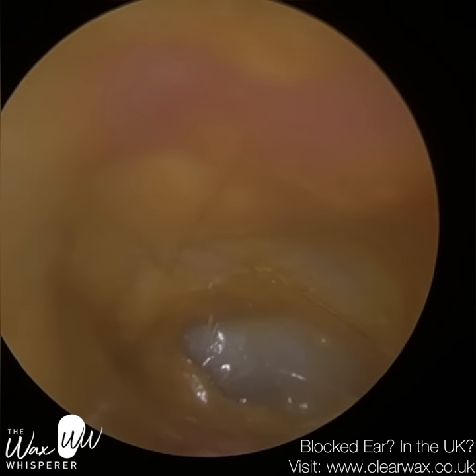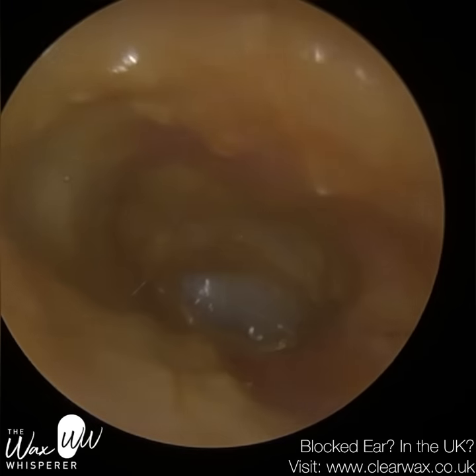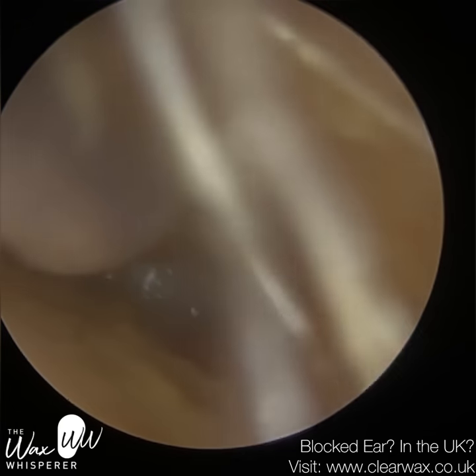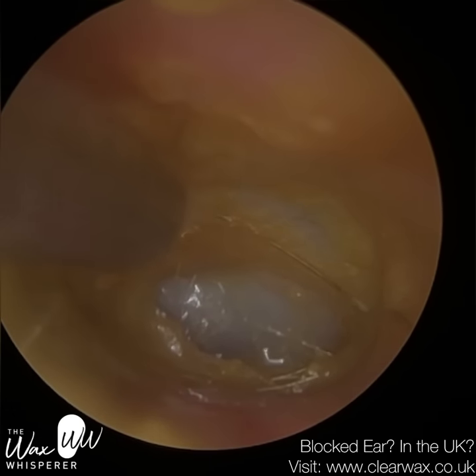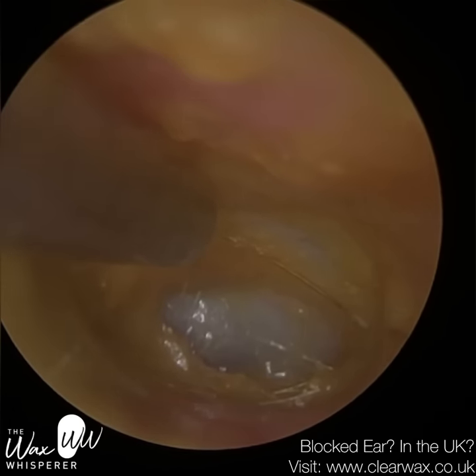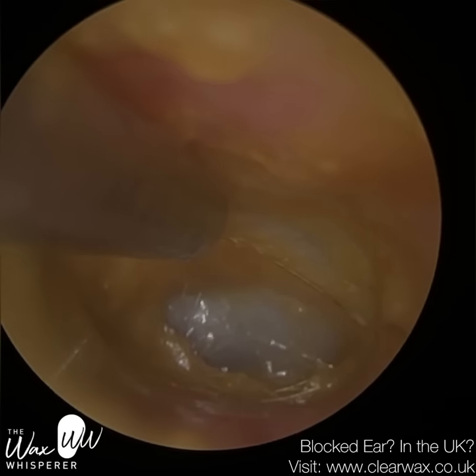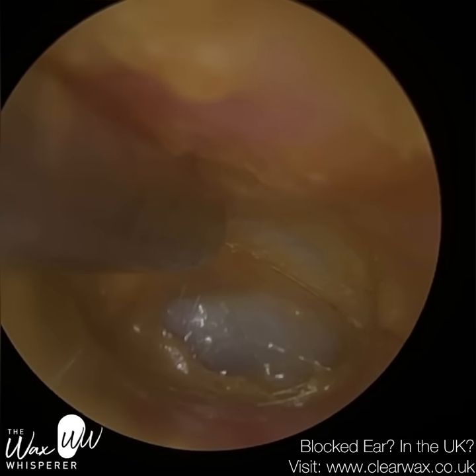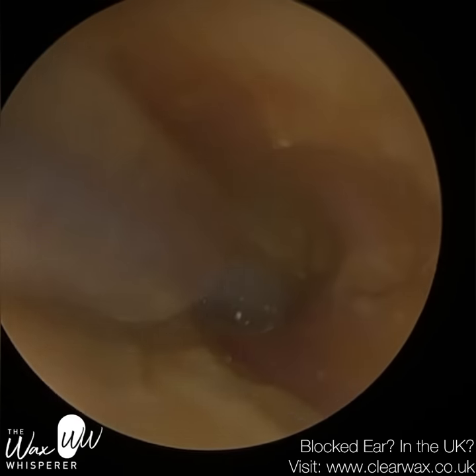Now we can see the majority of the eardrum, and at this stage this patient could hear significantly better. Everything else from here is a bonus. I know some people are not going to be happy at the end of the video because there's a bit left here and there, but my main objective is to get this patient hearing and not to cause any discomfort in that process, which thankfully we've managed to achieve. The patient is very grateful again. I'm now just going to spend as much time as possible to remove this, and I'm trying to do this without touching the canal wall.